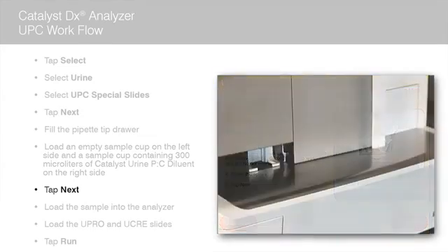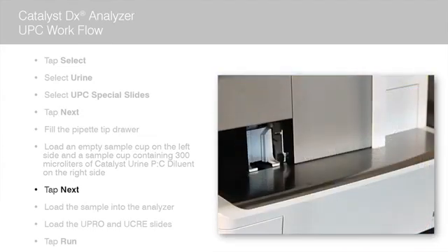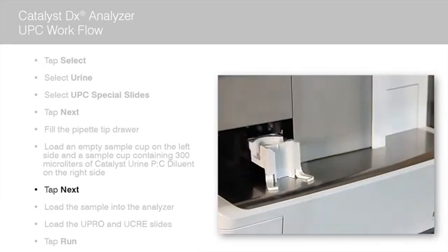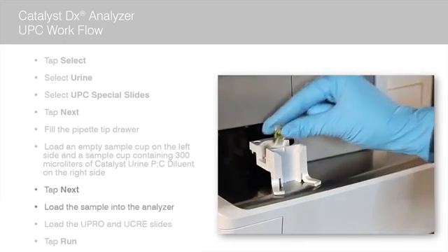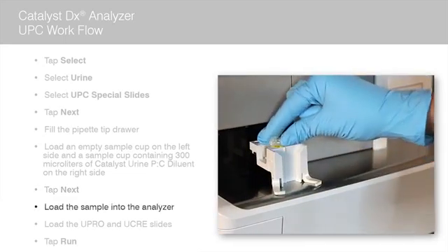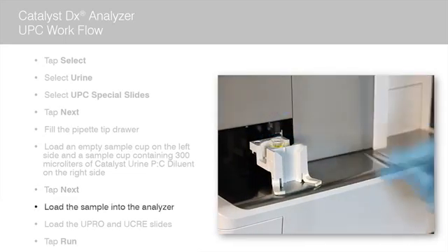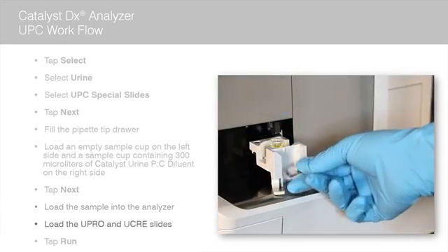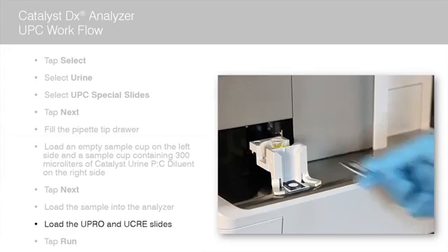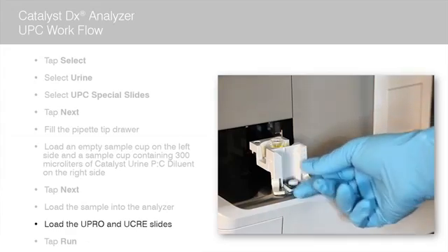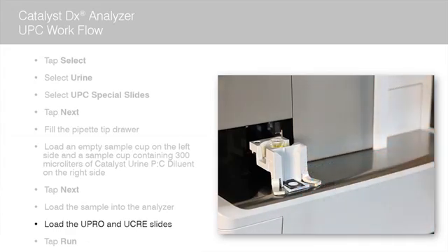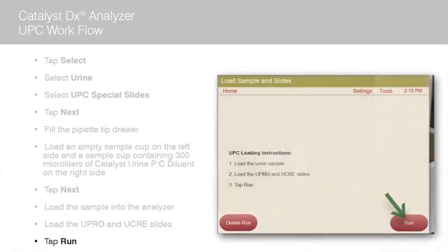Tap next. The sample drawer opens. Load the sample into the analyzer. Load the UPRO and UCRE slides. It is important that you do not load any other slides in a UPC run. Tap Run.